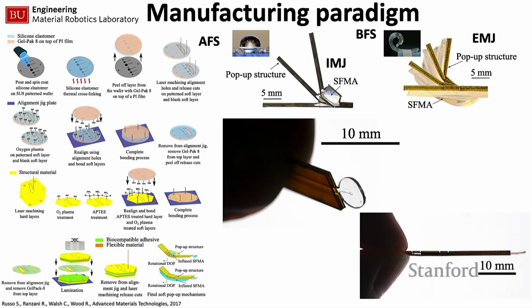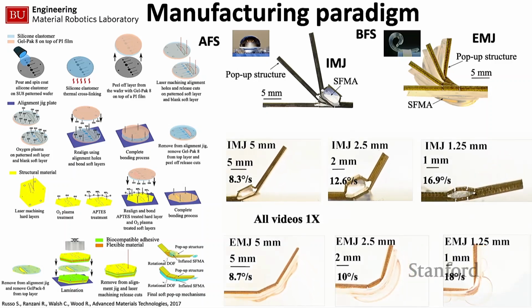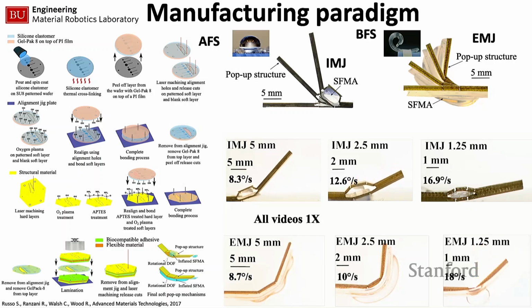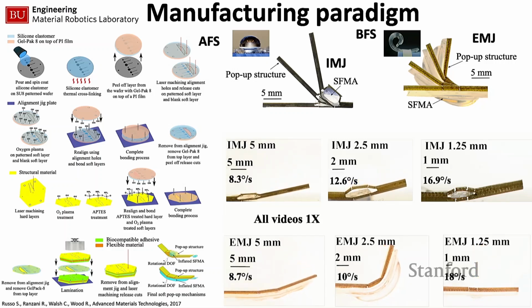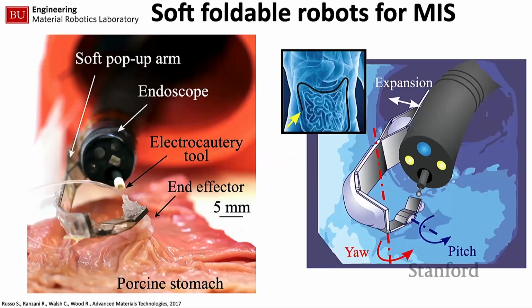These are my fingers over here. And by using microfluidics, we are able to have these soft, rigid actuators move around. They can do a pretty large range of motion. And also we are able to embed sensing, so achieving proprioceptive actuation. For example, in this case, we have a capacitive sensor. And as our soft micro actuator is expanding, we're capable of tracking the motion of this robotic actuator, but you could potentially also think about other types of sensing again.